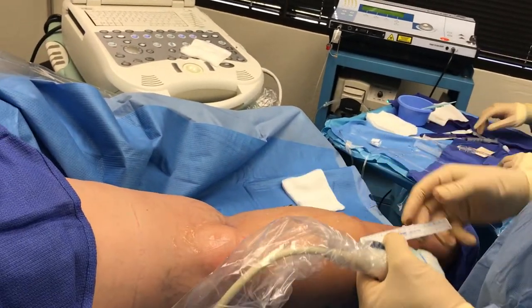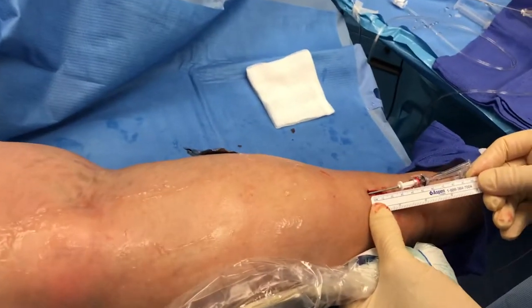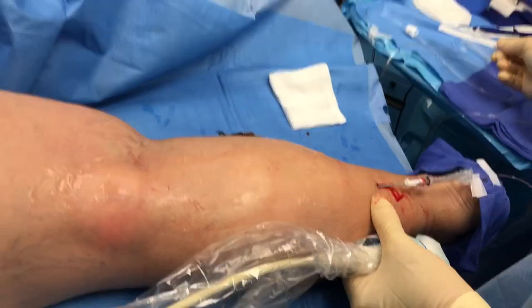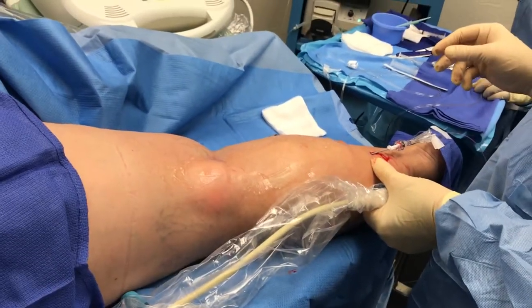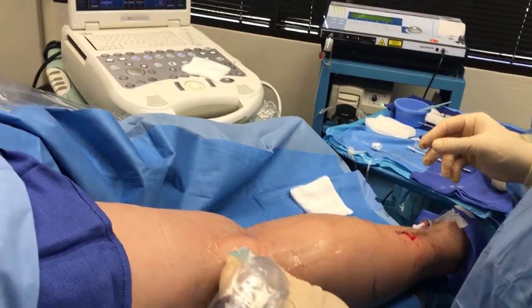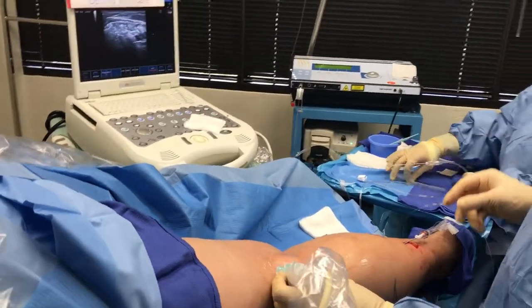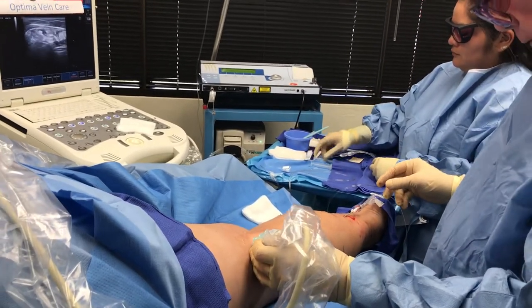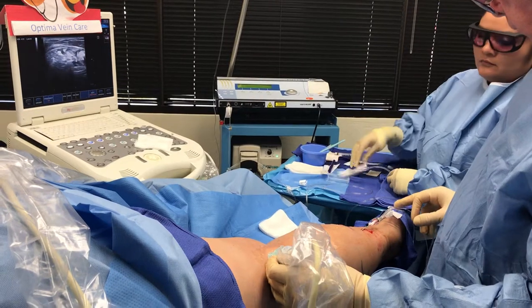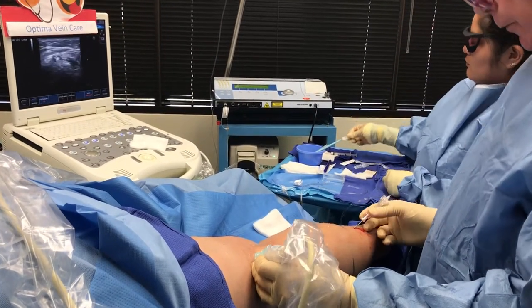We know this catheter is 30 centimeters long. We'll just measure what's out here — it's about 3 centimeters — so that means we've got 27 centimeters of catheter inside in the vein. I usually run the laser at about 6 watts when it's a continuous laser beam.